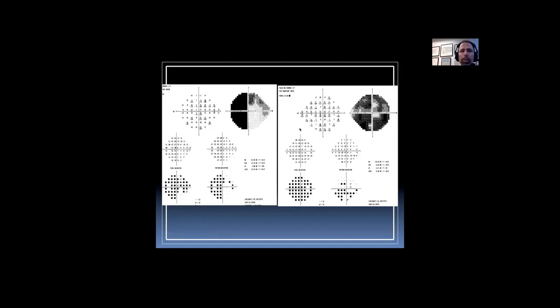Possible patterns of functional visual loss on visual field. I think the only thing that I've rarely seen is homonymous hemianopsia. I do see that temporal hemifield defect from time to time, because it's usually in a patient who has some medical background or has a relative who had a stroke, and they complain that they lost vision to one side. And even the patient who's had the stroke doesn't realize that they've lost vision in both eyes to the same side. In other words, they have a homonymous hemianopsia.